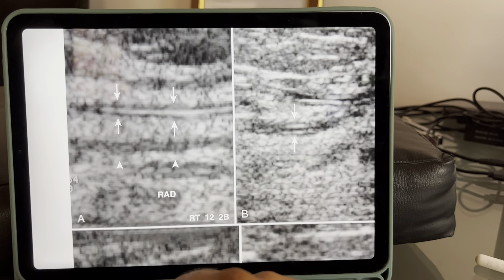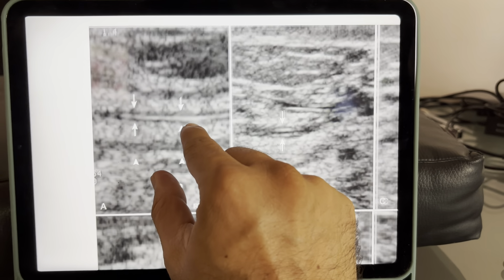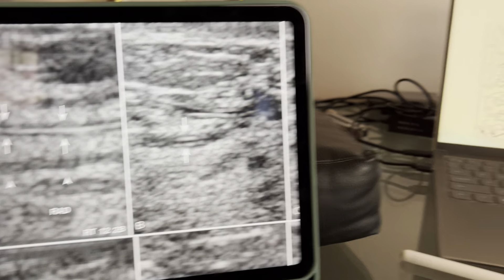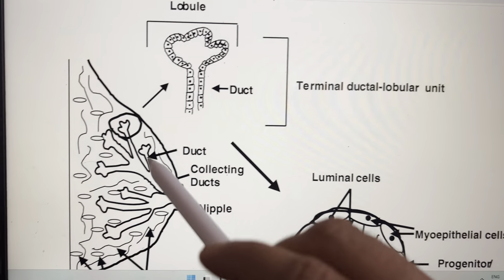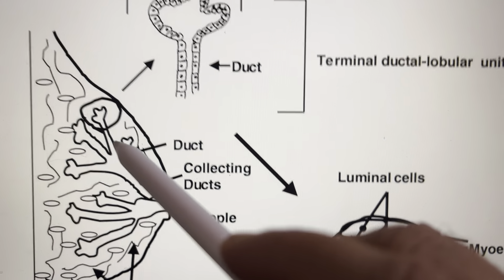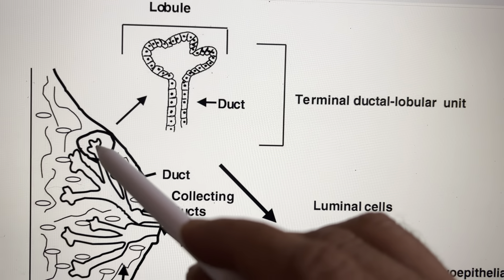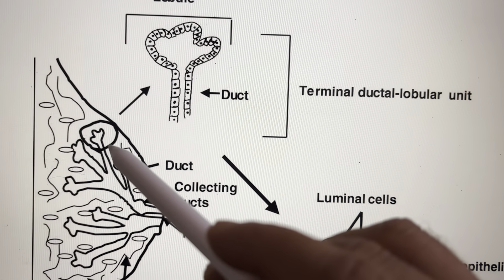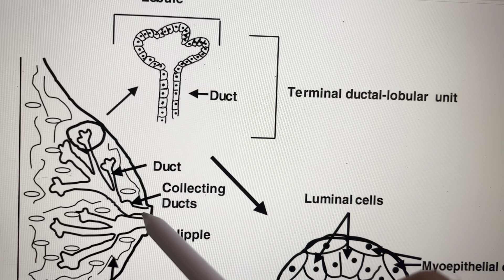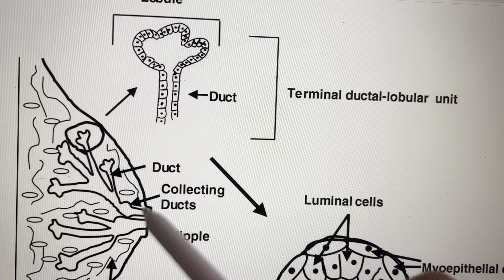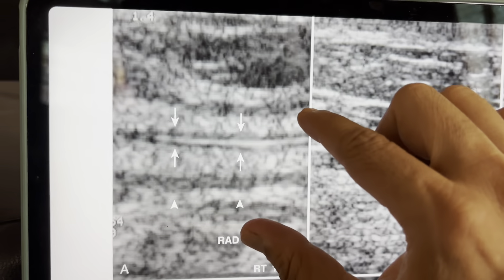First we will go through the anatomy of the terminal ductal lobular unit. The terminal ductal lobular unit is this anatomy of the breast — here is the duct, and this is the terminal ductal lobular unit from here to here. These ducts unite to form the collecting duct and they finally converge in the areolar region.